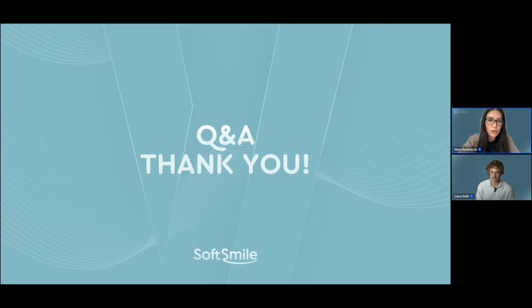Regarding the tooth with the complex movements, any suggestions on attachments that you should use on that one? Also, there are a lot of questions about bite ramps here: are you using the basic bite ramp provided by Vision, or are you customizing your bite ramp? I use the default bite ramps provided by Vision, but you can also upload your own STL files if you want to use your own bite ramps. And the other question was about the movements.